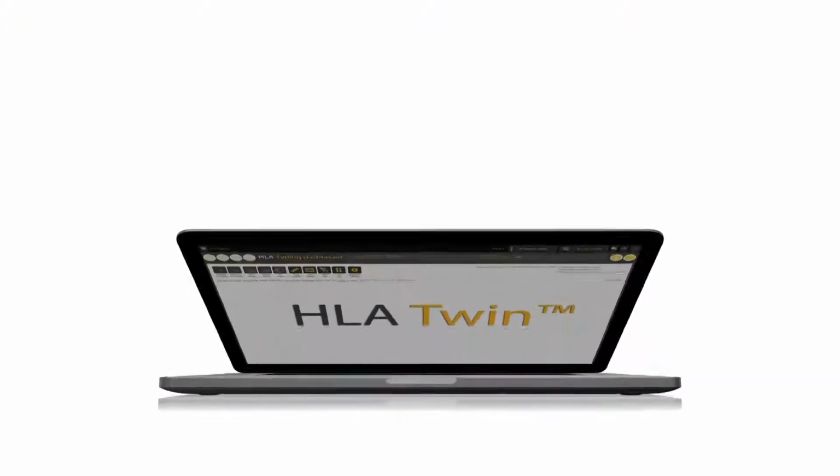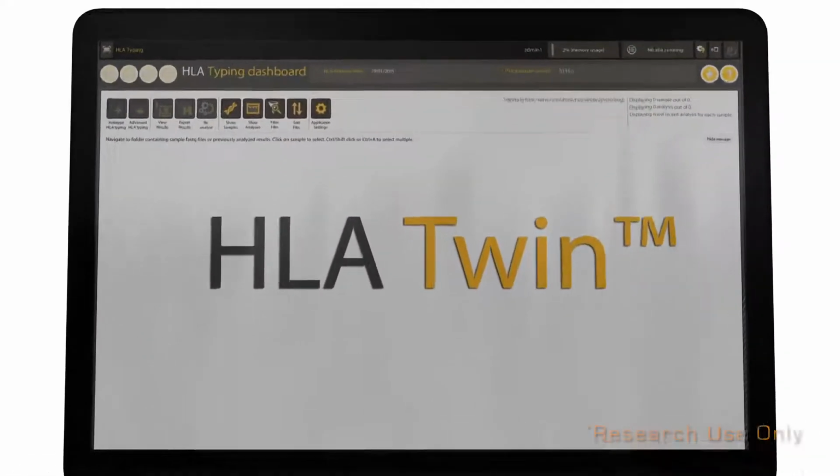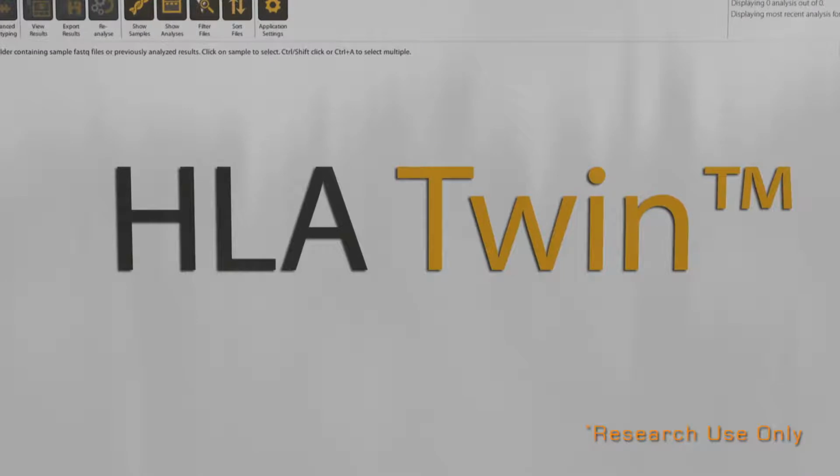In this video, I am going to introduce you to HLA Twin software that is used for HLA genotyping using NGS data processed by Omixon HLA typing kits.